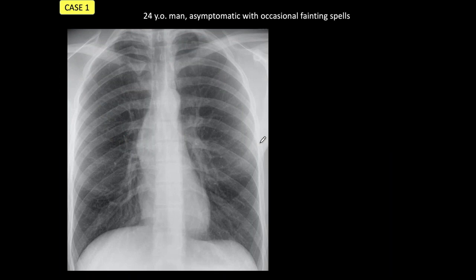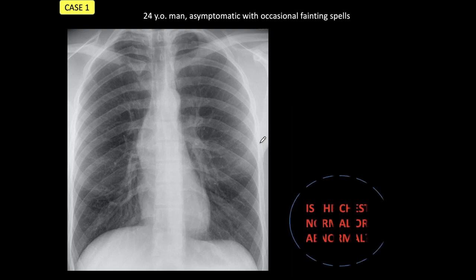Case number one belongs to a 24-year-old man, asymptomatic with occasional fainting spells, and I'm offering you a PA film. Our first question should be: is the chest normal or abnormal?